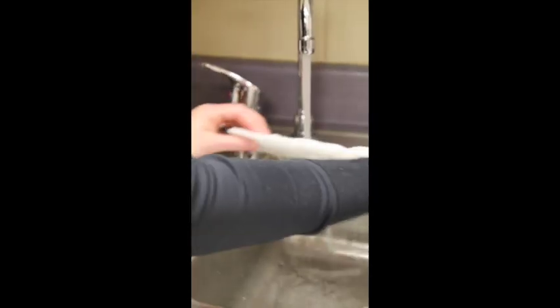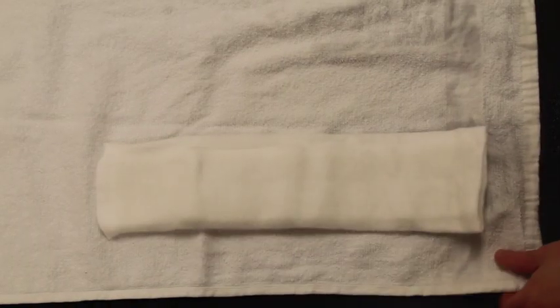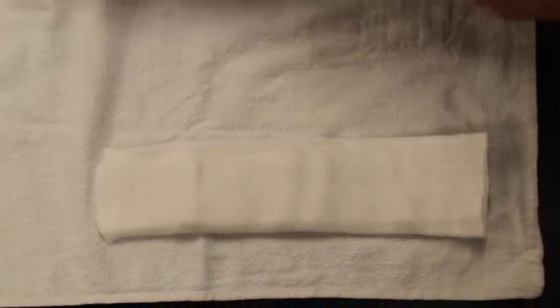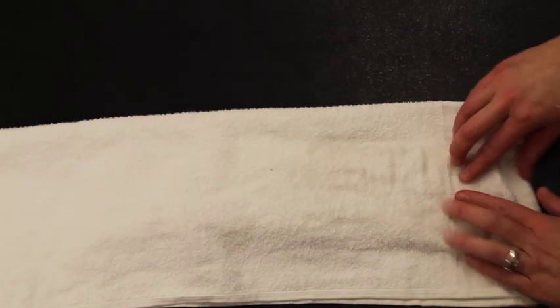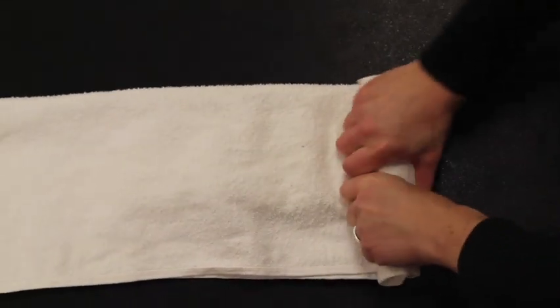Get the splint wet. Use room temperature to cold water, which will help it set up fast, and wring out as much water as possible. Place the splint in a towel, fold the towel over the splint, and wring out as much water as possible. I call this the burrito trick.